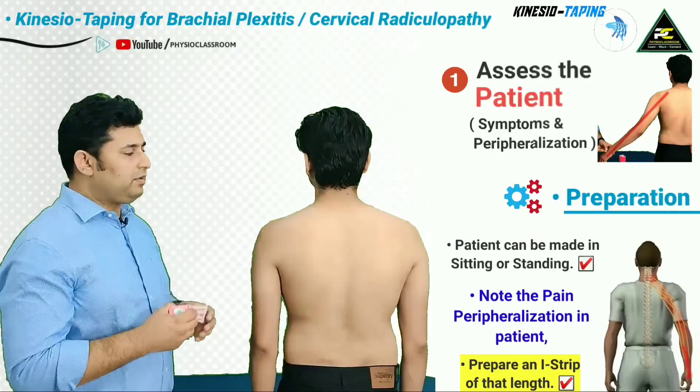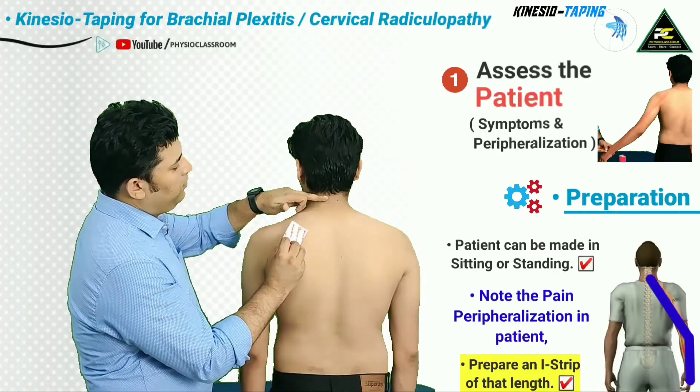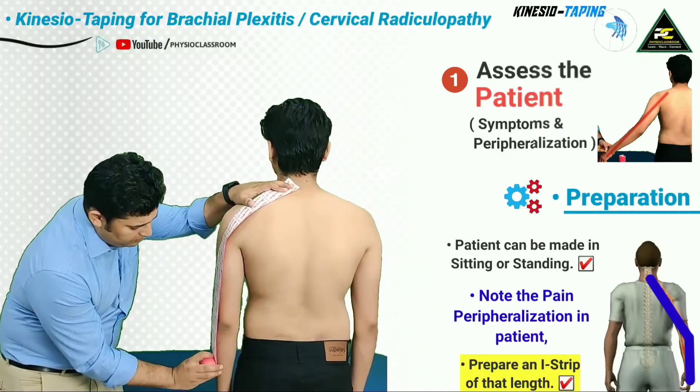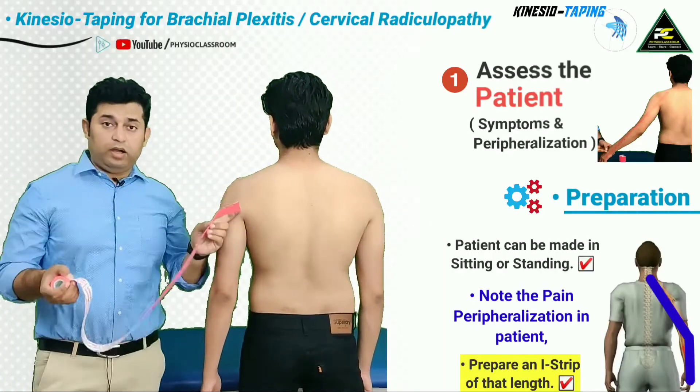For tape measurement, the therapist is going to measure from the base of the occiput or from the base of the hairline up to the most distal point of the pain, and this is where the therapist is going to cut the tape.